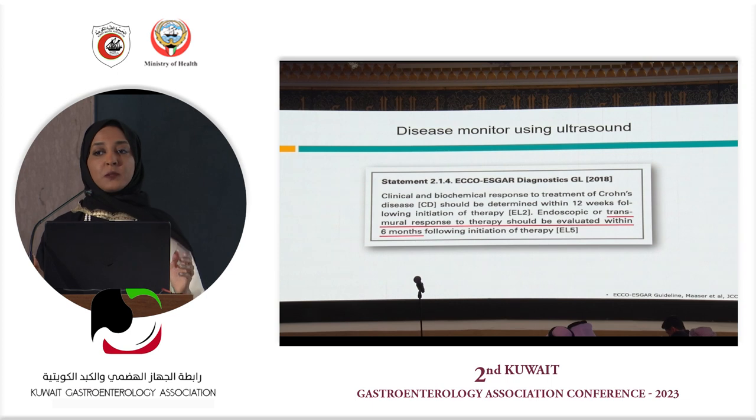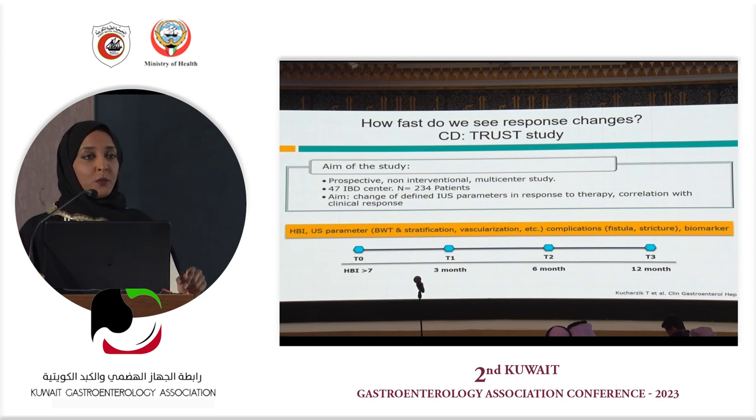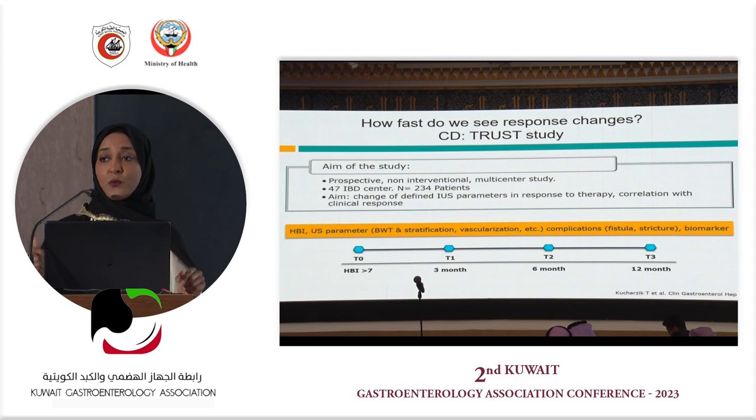So in our clinical practice, where can we position bowel ultrasound in our IBD patients? Actually, according to the ECCO guidelines, we have to monitor the bowel wall inflammation and measure the bowel wall thickness after 6 months of starting the medication. But some doctors would say, well, we don't want to wait. How soon can we do the bowel ultrasound?